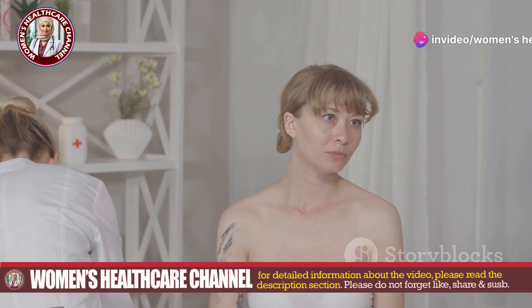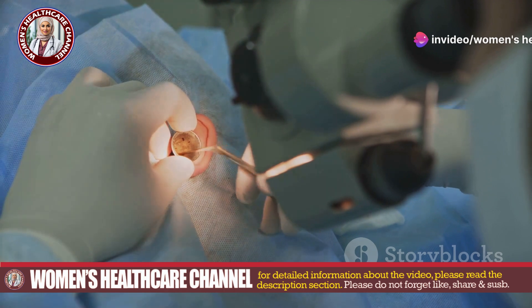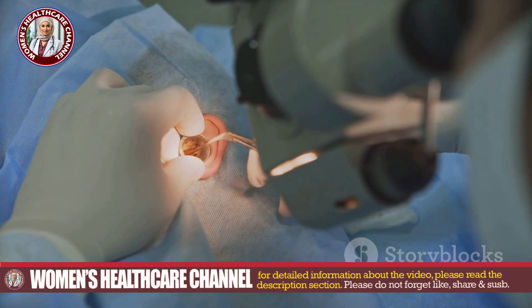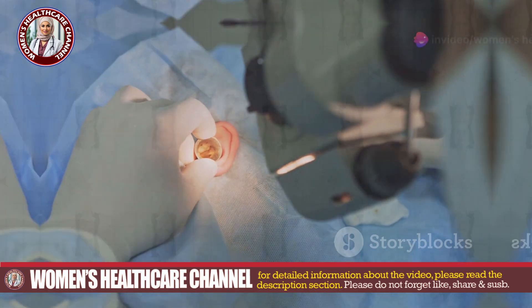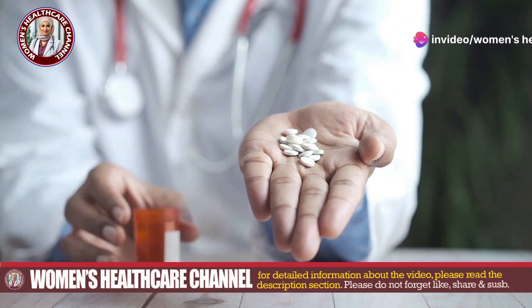First, let's go over the materials you'll need: sterile gloves, sterile gauze, an ear speculum, an otoscope, normal saline solution, hydrogen peroxide solution 3%, forceps or tweezers, a suction device, antibiotic ointment, prescribed antibiotic medication if necessary, and pain relief medication if needed.